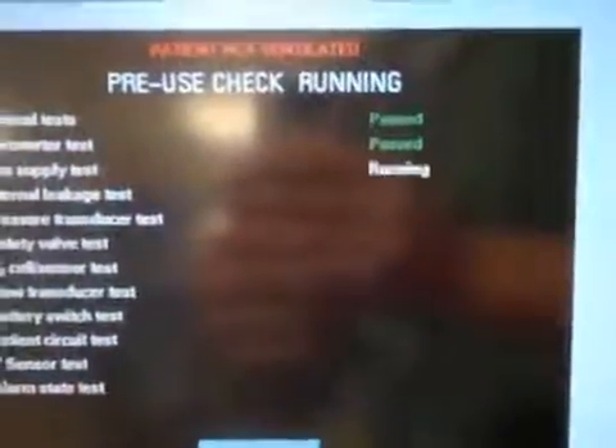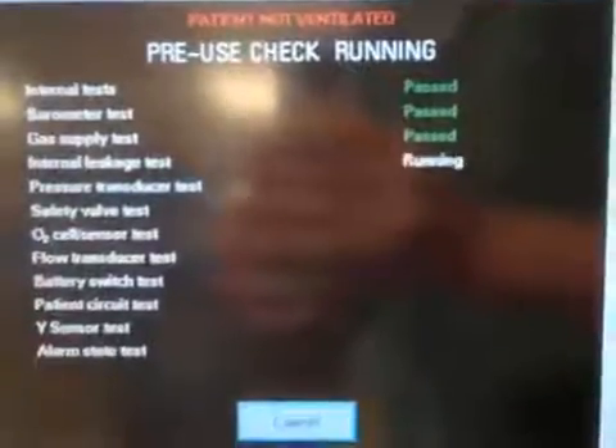Now it's running through a gas supply test, internal leakage test, pressure transducer test, safety valve test, O2 cell and sensor test — which it will fail because we don't actually have oxygen piped into the machine here in the lab. Then it continues with a flow transducer test, battery switch test, patient circuit test, and a Y sensor test.